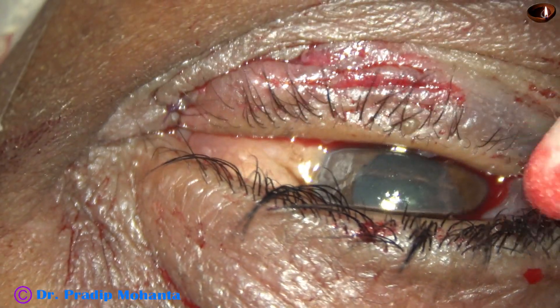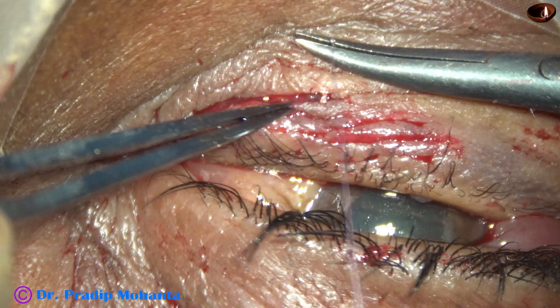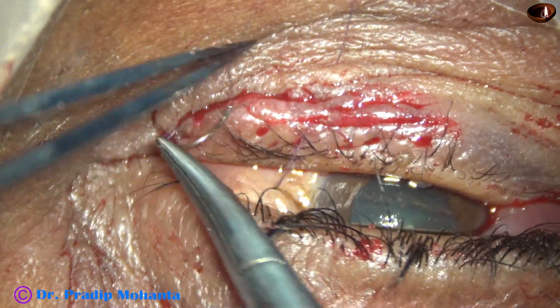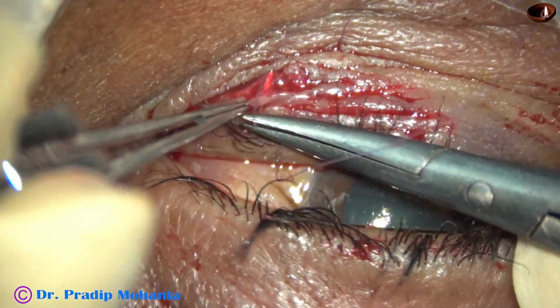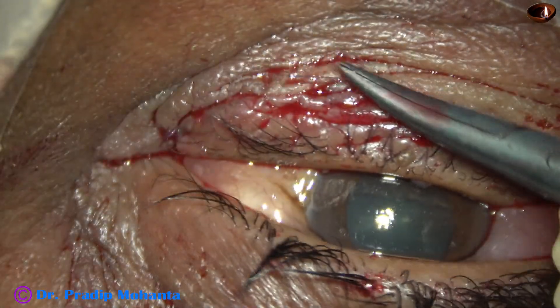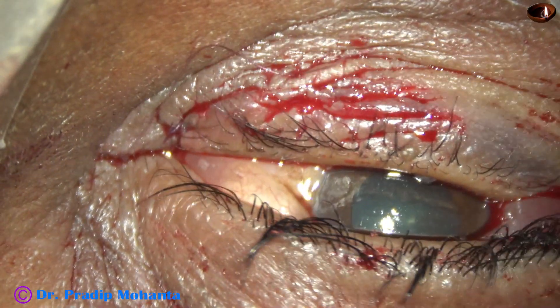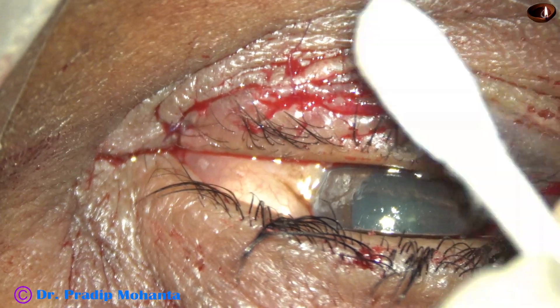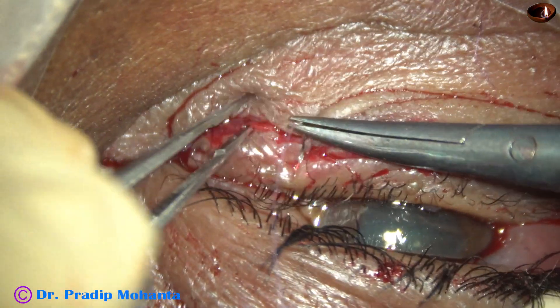Now, a deeper cut is a little below here. This video is running at two times normal speed, so don't think that I am taking decisions so quickly — I am taking a lot of time in doing this. So, this is the first mattress suture here. And now, one more mattress suture here.